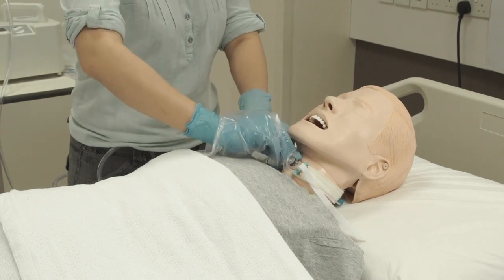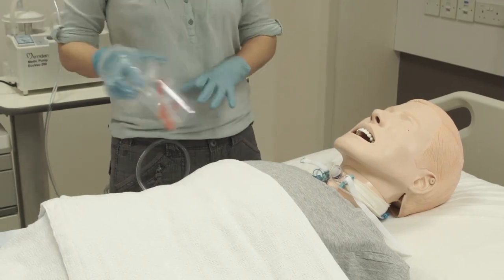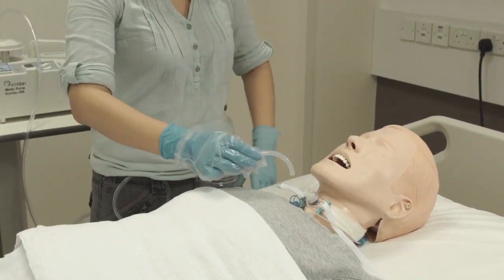Remove the inner cannula with one hand holding on to the flange to stabilise the tube. Replace it with a clean inner cannula.